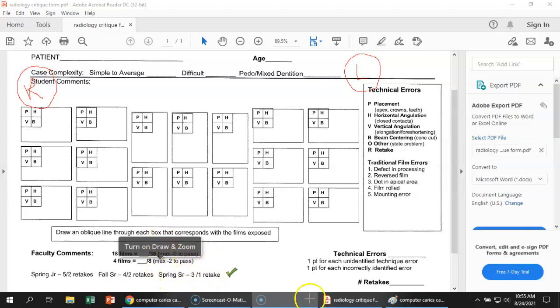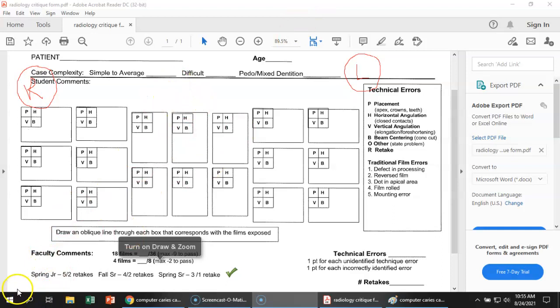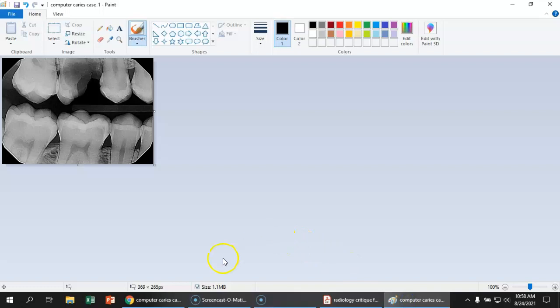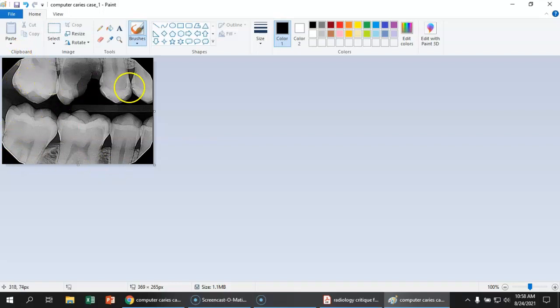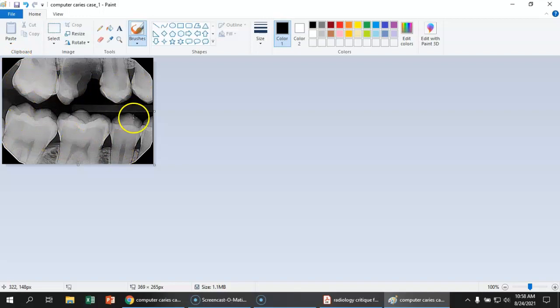Okay, so what we're going to do is I'm going to click over here to this image. I have to go back to my pointer. So we're going to look at this radiograph here, and we're going to critique it. So let's start with the first one that was the placement. So we want to look at the placement. First you have to decide if you're looking at a bite wing, or if you're looking at a PA, or a periapical. And we are looking at a bite wing, because we see the crowns of the maxillary teeth, and we see the crowns of the mandibular teeth. And the occlusal plane is pretty much centered. So we know that we're looking at a bite wing film.